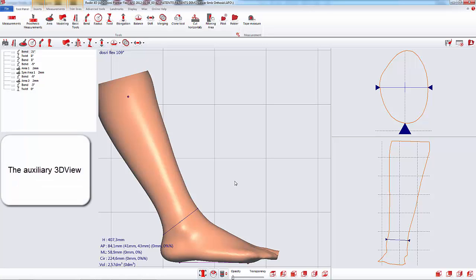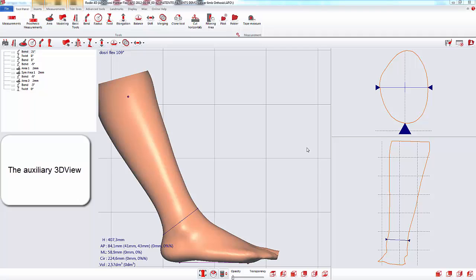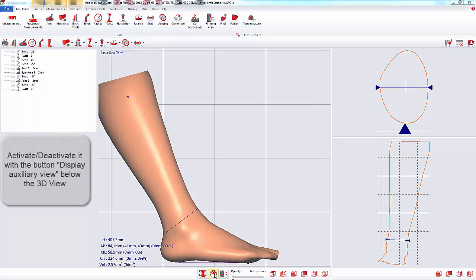In this video, we will see how to use the Auxiliary 3D View. You can activate this view by clicking on this button.